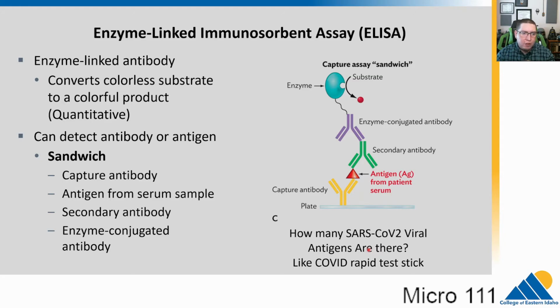The most common ELISA, and the one that you're probably actually familiar with if you've ever taken the rapid test, is called the sandwich ELISA. Not because we're looking at sandwiches, but because we make an enzyme sandwich here, basically. On the plate, we put an antibody that captures a specific antigen. This could be the COVID-19 spike protein. We then use a secondary antibody to wash over that will bind to this and cause it all to stick together. This has a secondary antibody that gets conjugated to it, and with the color on it. And this whole sandwich will then make a color at this point.